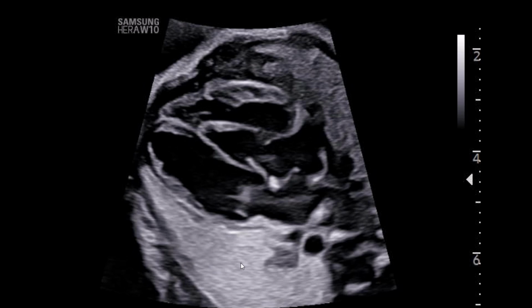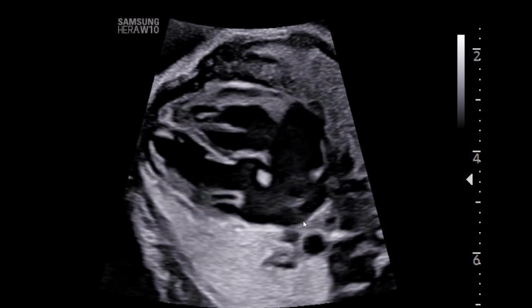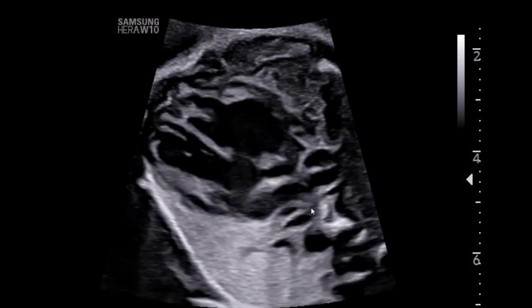And so now we'll just summarize our connections in situs. And so again, this is posterior, the spine, this is anterior here, this is left and right. And so the apex of the heart is pointed leftward. So this is levocardia. You have the morphologic left atrium, which receives the pulmonary veins here.